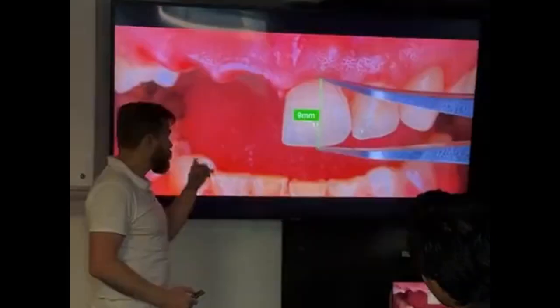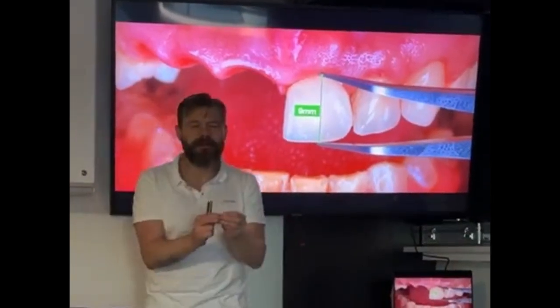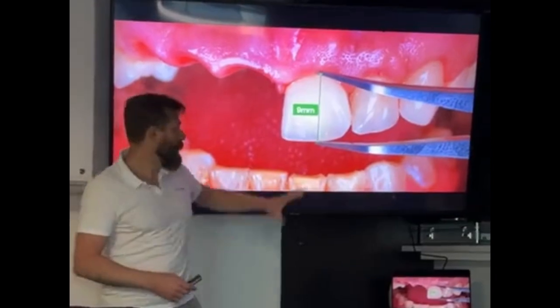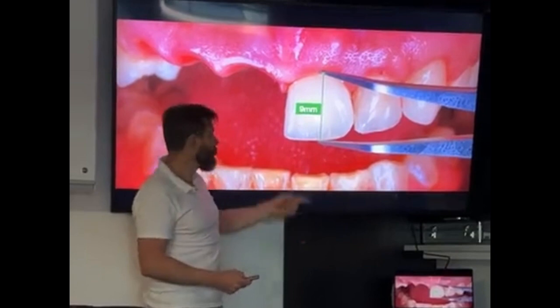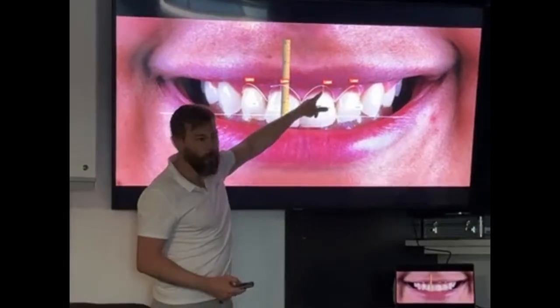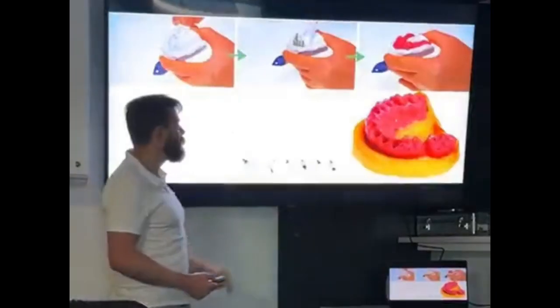Then what I'm going to do? Last day we discussed crown lengthening, do you remember? Yeah, we're going to use something very similar to the steps of crown lengthening, but I'm going to modify the tissue contour on the cast. I'm going to take one measure from one of the teeth before taking it out. Why is that, Ricardo? Because I'm going to have the calibration of my ruler here, so I'm going to know exactly that the tooth is 9 millimeters and I need to add plus 1.5 millimeters.